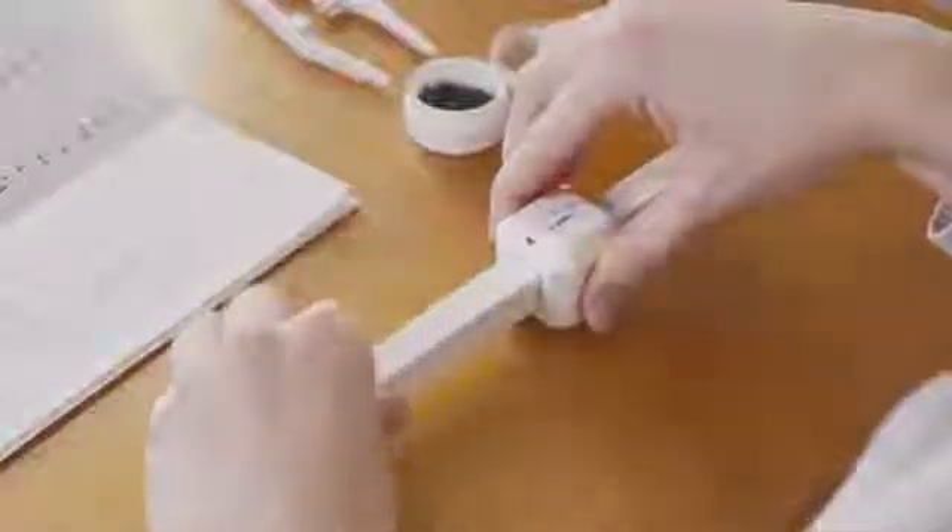Finally, slide the slate into the Brailler cube and push in and out two to three times. When you're finished, you'll have a label printed in Braille.